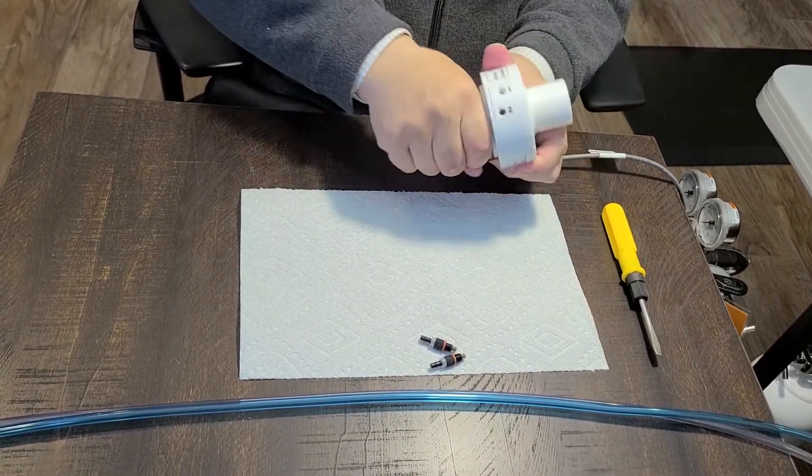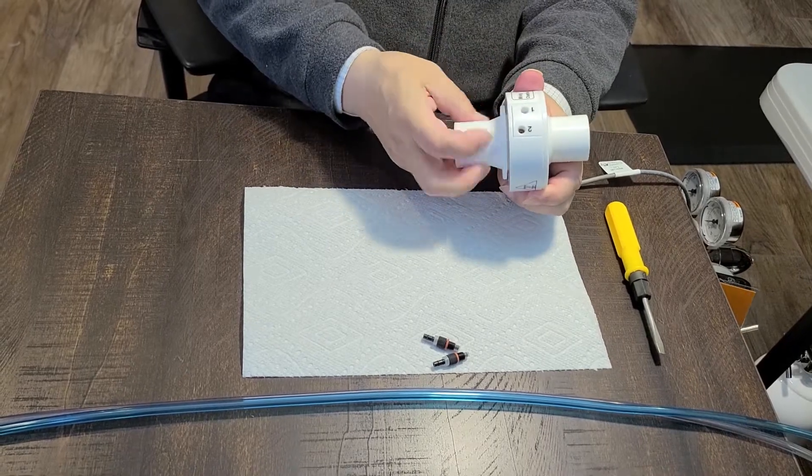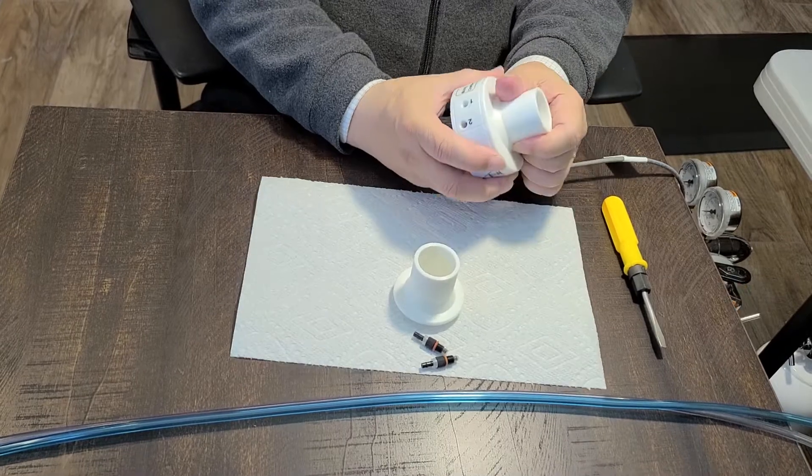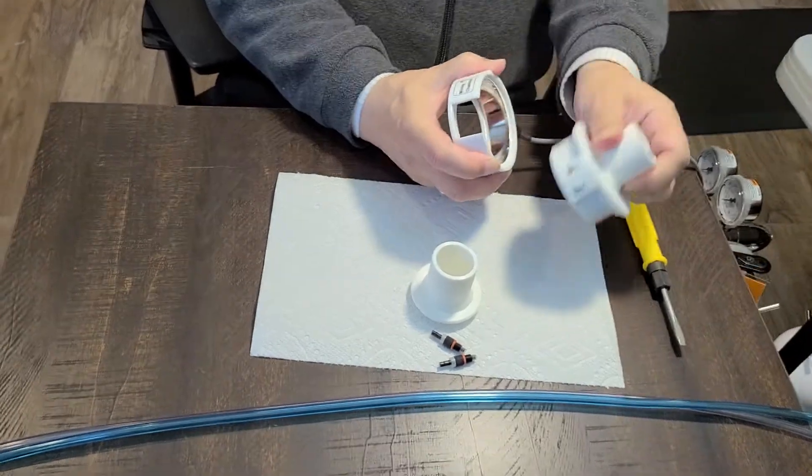Then we unscrew the small French port tube. Pull apart the heater shell.